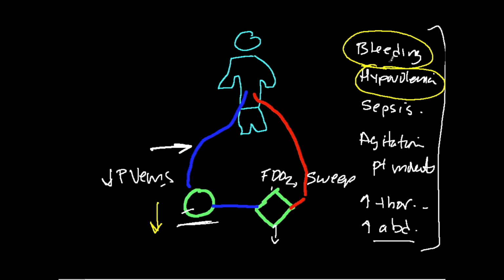So if it looks like it's bleeding, obviously you're also going to stop your heparin, but make sure that your flows are such that you can support the circuit without clotting it off without anticoagulation. So these are the big ones that you'll be taking care of. A lot of times it's just a matter of turning the flows down, giving a little bit of albumin or normal saline back, and then just trying to achieve the steady state.